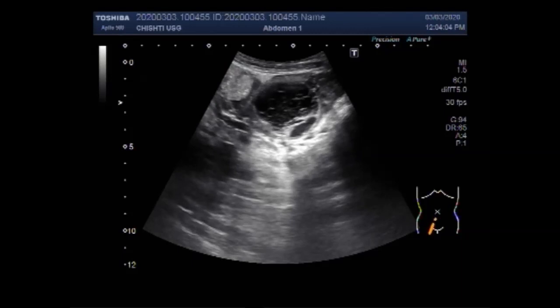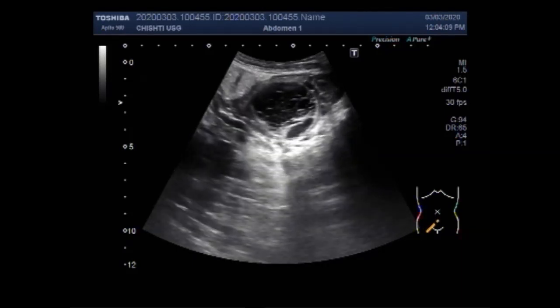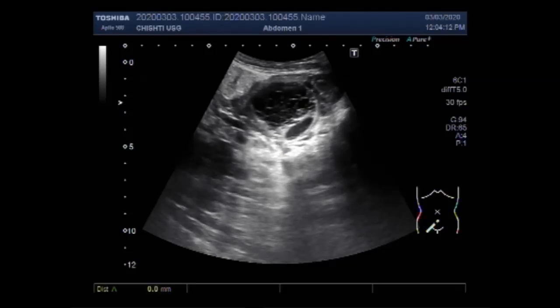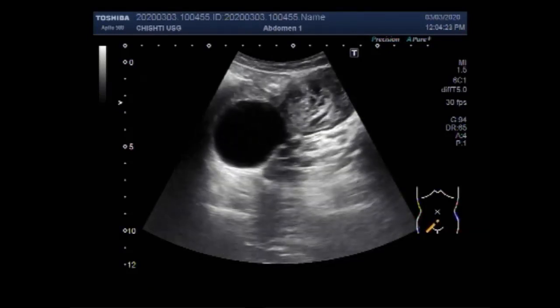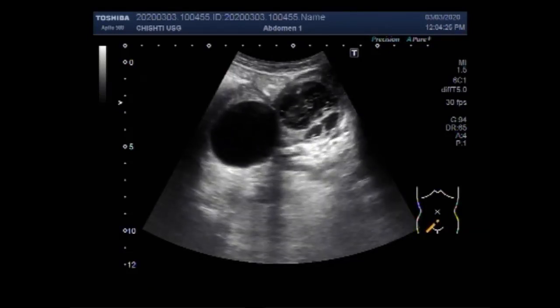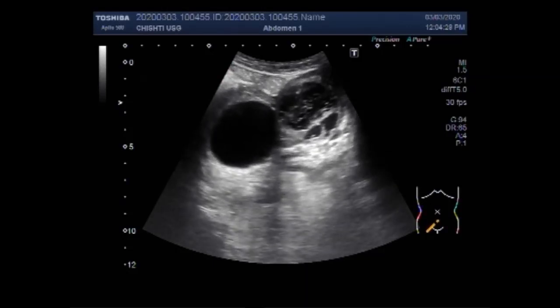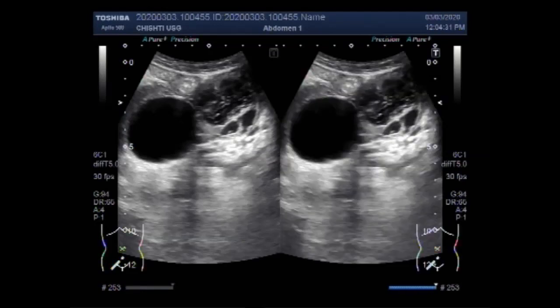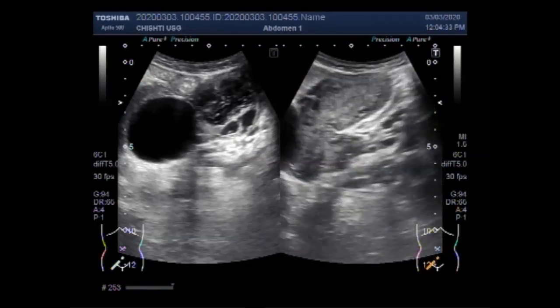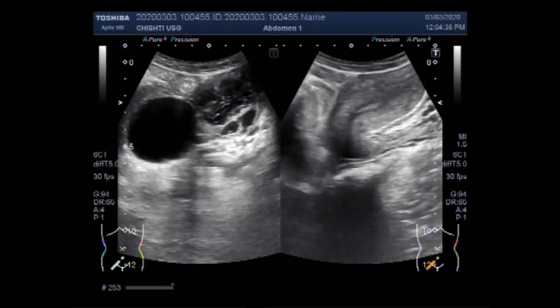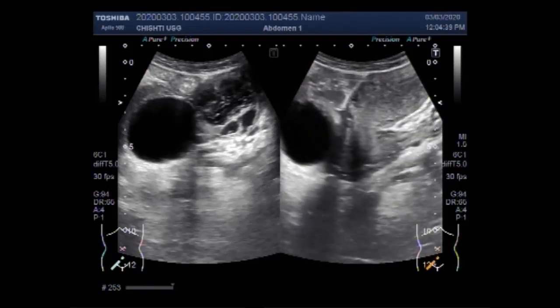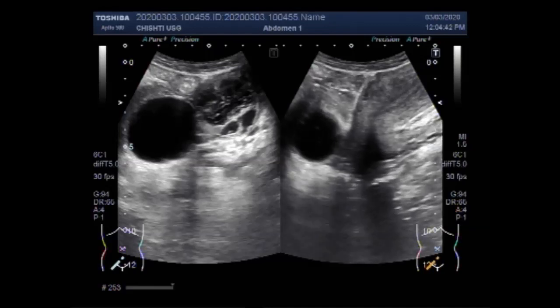Follicular cysts typically dissolve after releasing the egg, but if the sac doesn't dissolve it may cause corpus luteal cysts. Other types of ovarian cysts include dermoid cysts — sac-like growths on the ovaries that can contain hair, fat, and other tissue — cystadenomas, which are non-cancerous growths on the outer surface of the ovaries, and endometriomas, where tissue that normally grows inside the uterus develops outside and attaches to the ovaries.